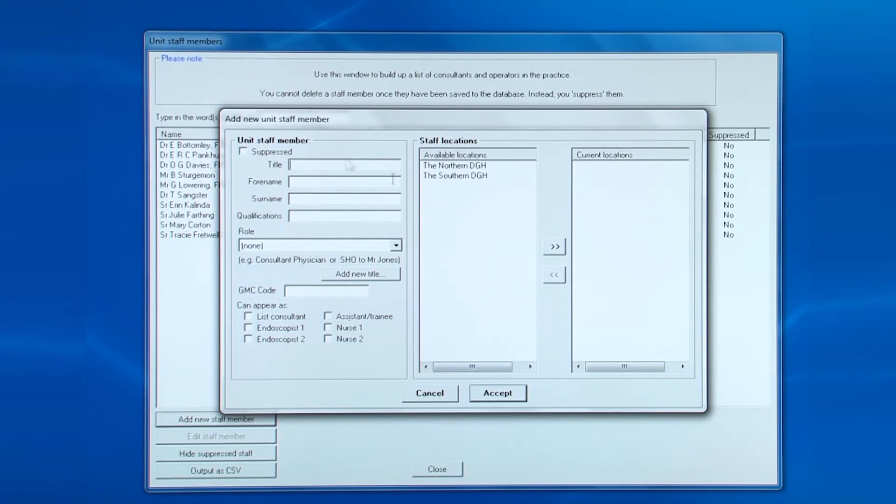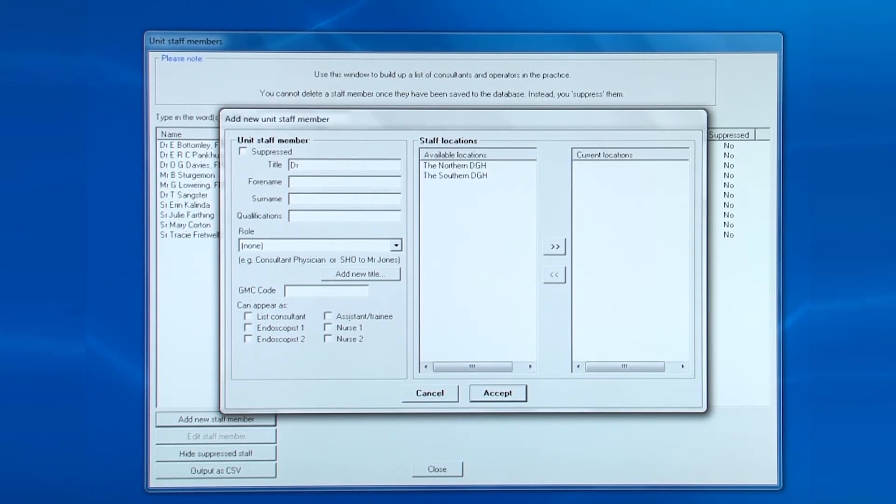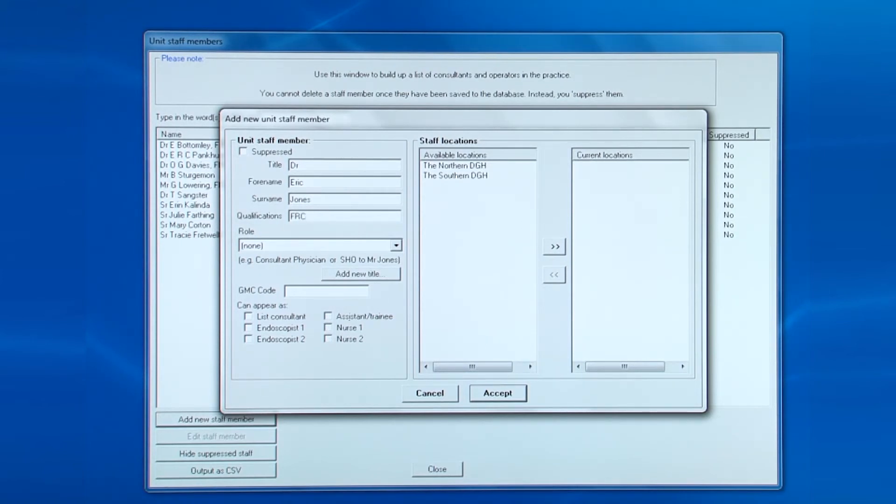Enter the details in normal case, not all in capitals, as this is how you want the details to appear in the report. Also, take care in entering the details as you cannot delete a staff member once added into the database. You can only suspend them from that list.